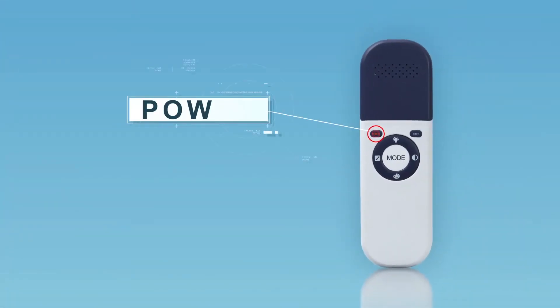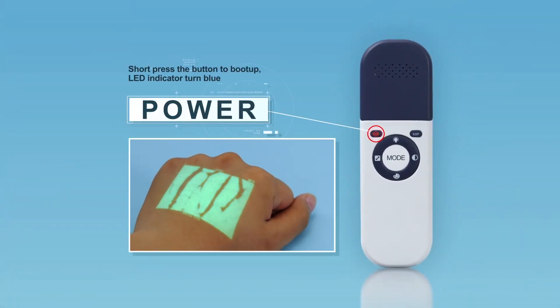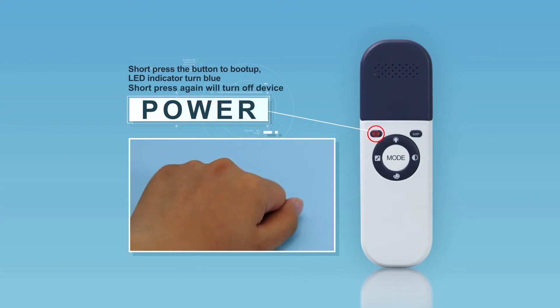To power on VeinFinder, short-press the power button. Short-pressing this button again will turn the device off.